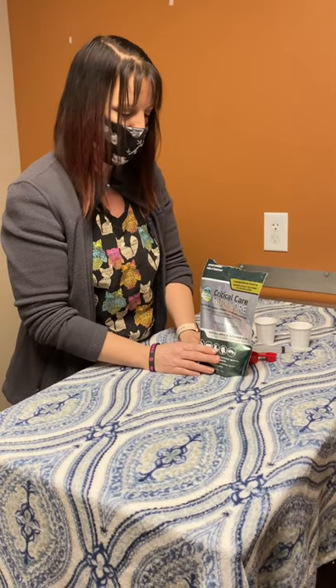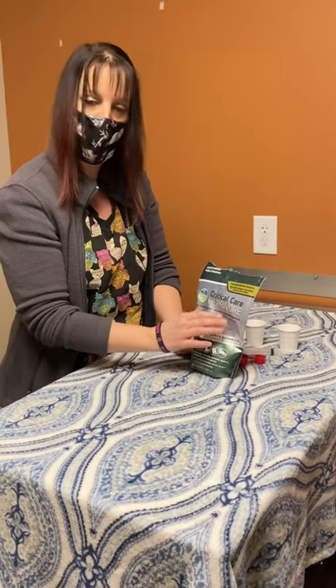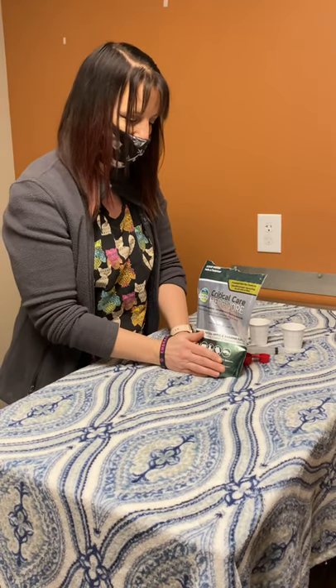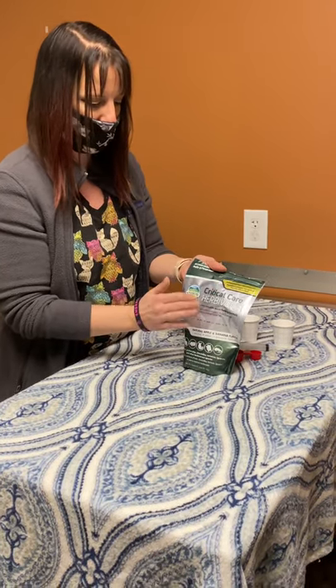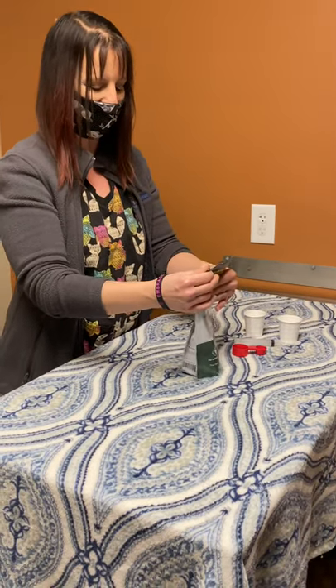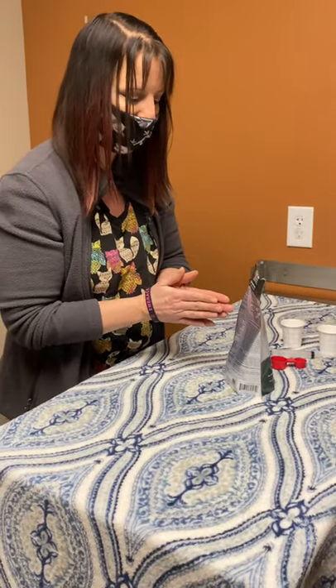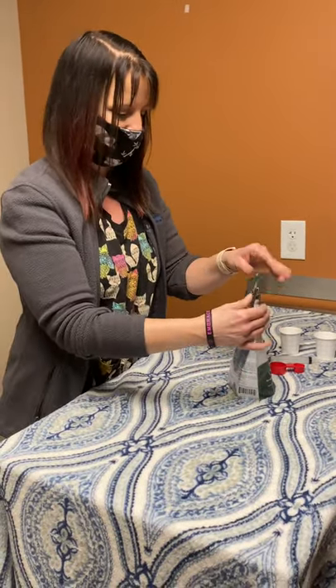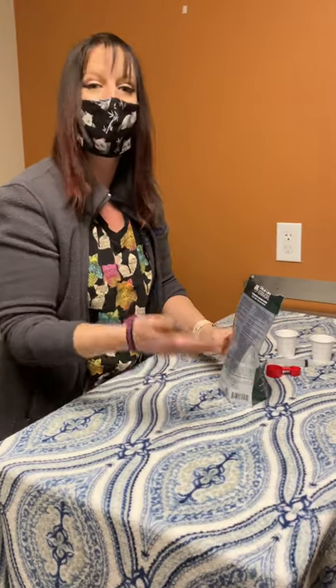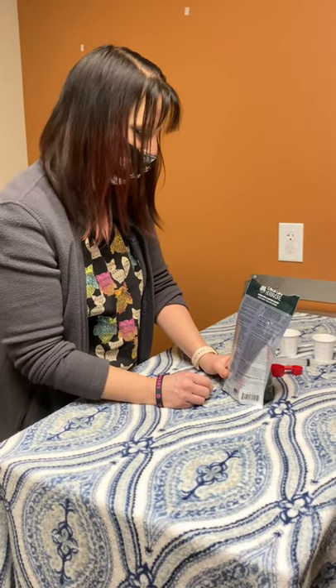Hi, today I'm going to show you how to mix up critical care herbivore solution and how to syringe feed your guinea pig. We use critical care for those pets that are either after surgery, to make sure that they're eating enough, or if they're sick and haven't been eating or losing weight. This is a supplement that helps get them the nutrients and the calories that they need.